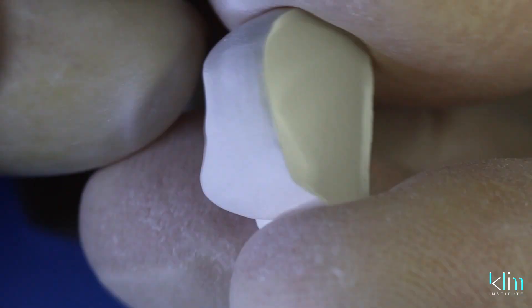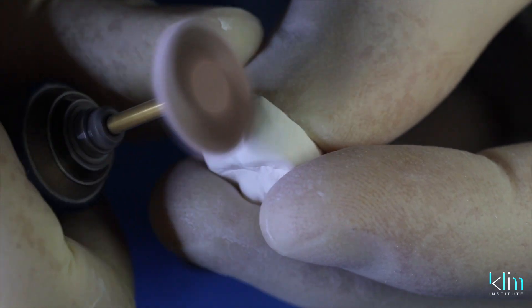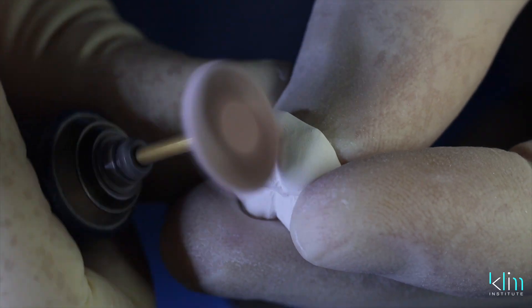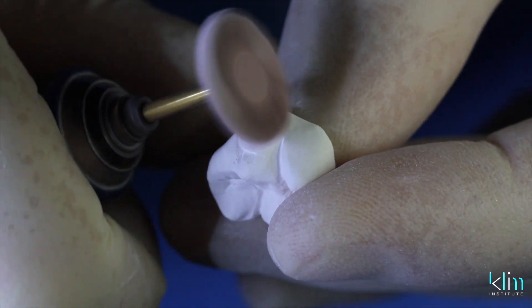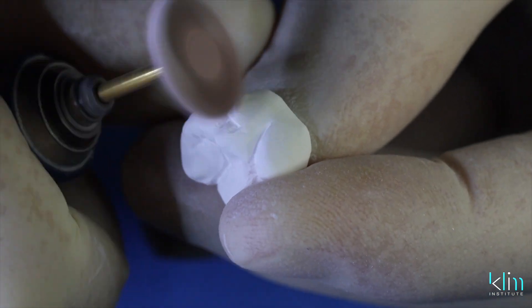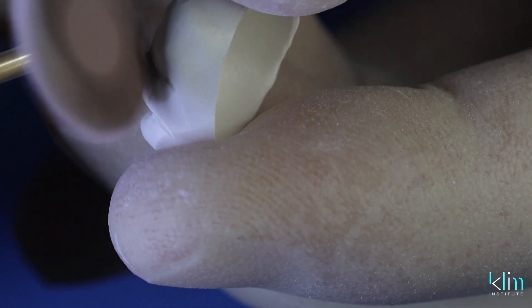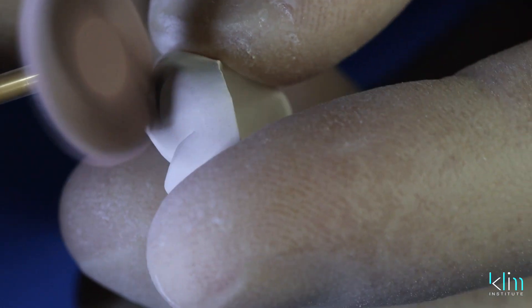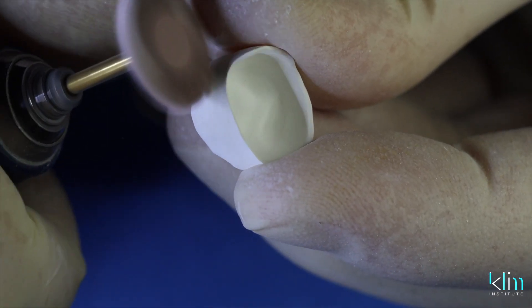Stay approximately cervical to the contact so we don't open up that contact. Polish away from the margins at around 10,000 RPM with a soft touch. The pink twist polisher is very forgiving — it won't gouge — and just work that surface until you see what you want.